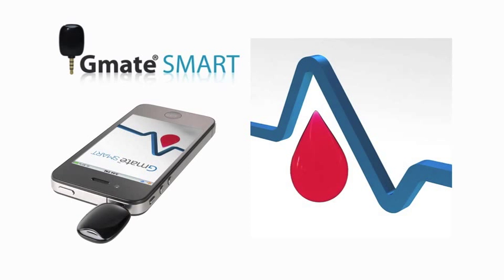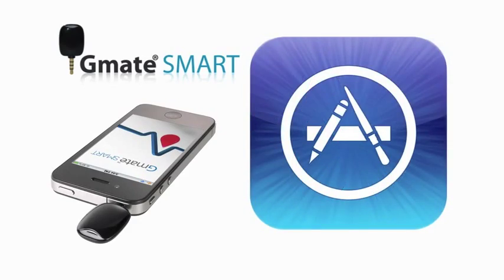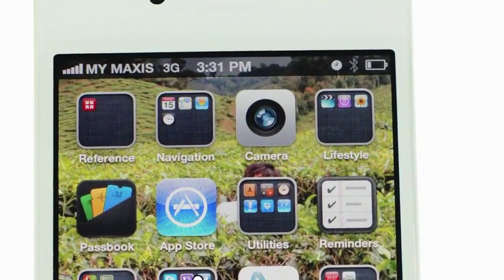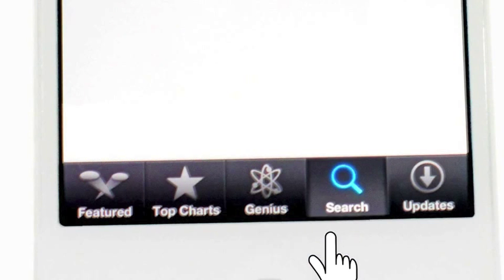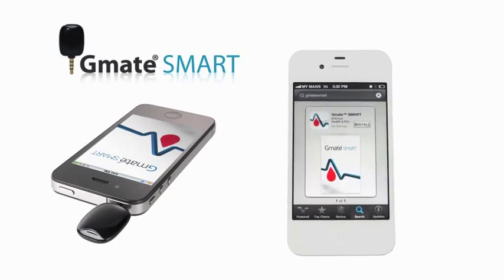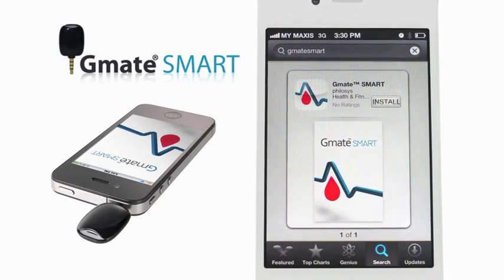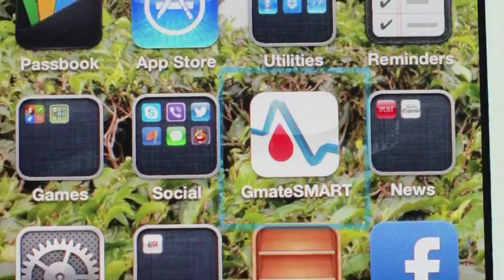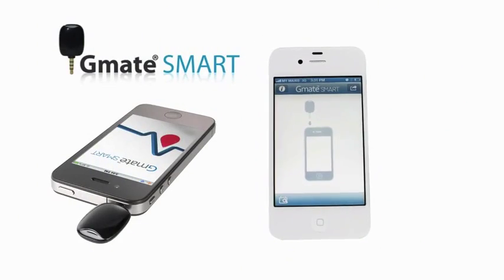The G-Mate Smart application is a free download from the App Store. To download directly on your smartphone, tap on the Application Store icon and select the Search tab at the bottom of the screen. Then type G-Mate Smart into the search bar at the top. Select G-Mate Smart from the list, then tap Install. Tap the G-Mate Smart icon on the smartphone to open the application.